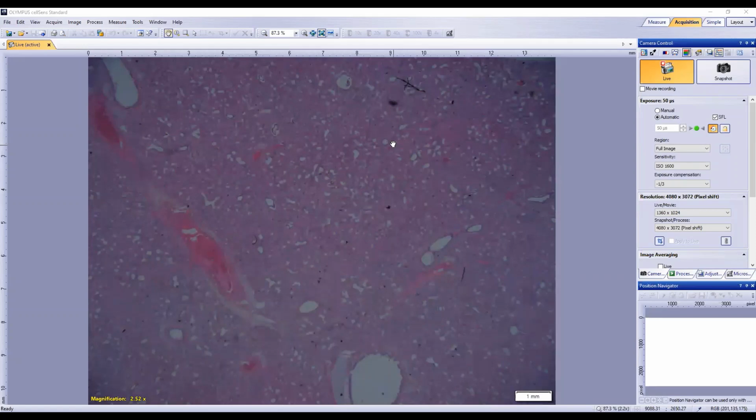Well, we did see some of the structures before in even lower magnification. So at 6, we've got that bronchus. Yep. And I imagine it's a bronchus because what is to 9 o'clock from the lumen looks like a cartilage plate. Exactly. And then I would say the other smaller tubular structures, sorry, I'm Spanish, so I sometimes struggle with my English. No, you're doing great.